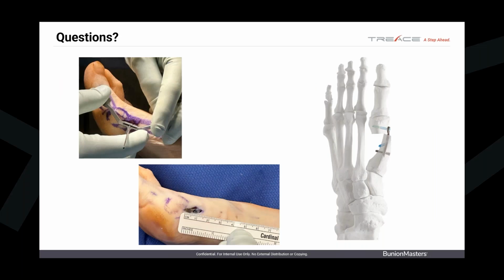The other benefit is, in order to put the percuplasty screws in, you have to crank the proximal metatarsal medially to get those screws at the right angle. There's no motion at the TMT anymore. That's harder to do. So the nanoplasty almost perfectly works for reconstruction of a failed lapidus procedure. It is my instrument of choice for correcting those.